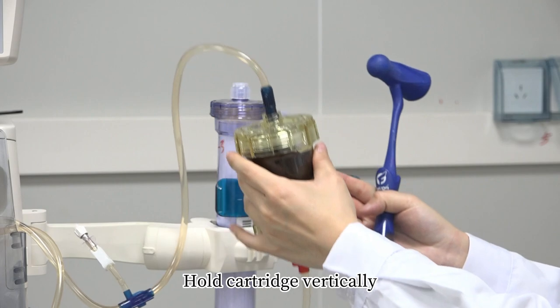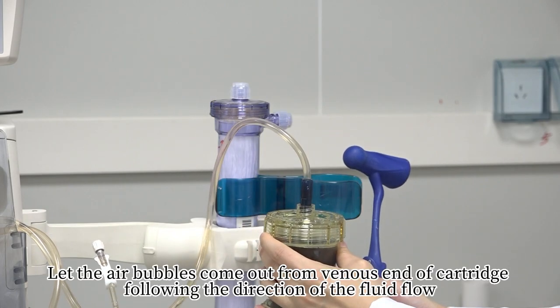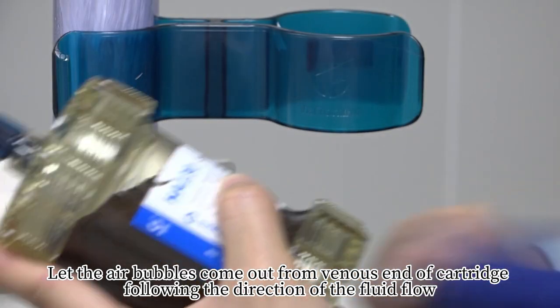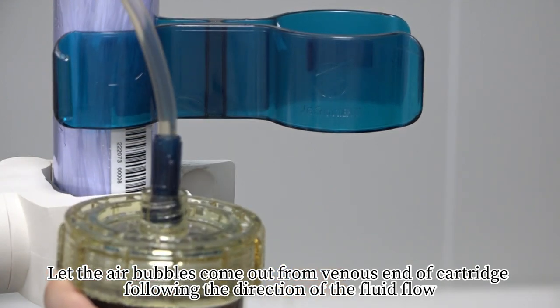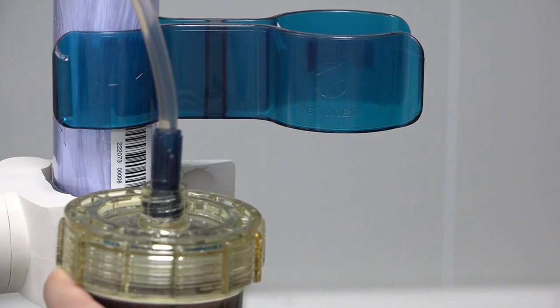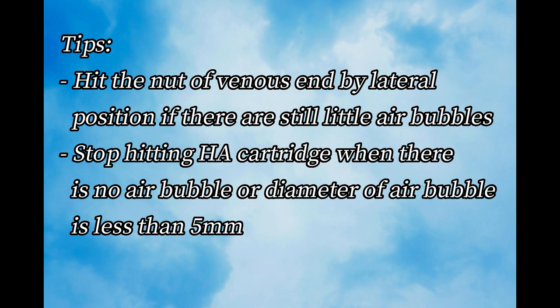Hold the cartridge vertically. Let the air bubbles come out from venous end of cartridge following the direction of fluid flow. Tip: Hit the nuts of venous end by lateral percussion if there are still small air bubbles. Stop hitting HA cartridge when there is no air bubble or the diameter of air bubble is less than 5mm.